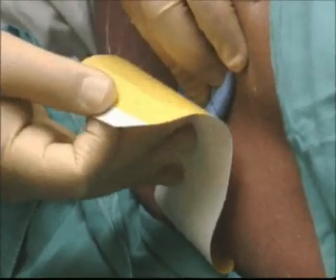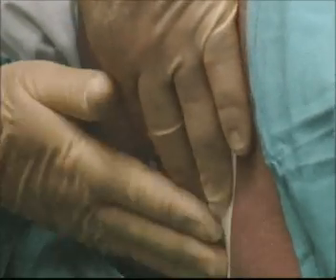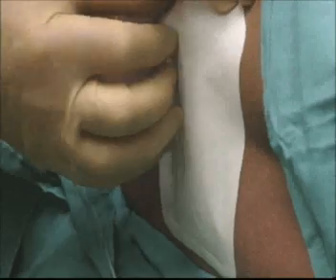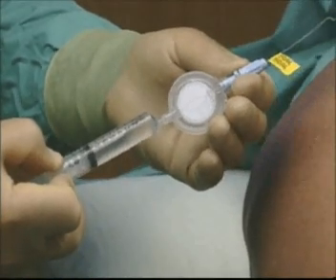Having further established that the catheter is in the epidural space, a gauze pad is positioned over the point of insertion and secured with a sterile transparent dressing. The catheter is taped along the patient's back to lie at their right shoulder. The main anaesthetic dose can then be administered.